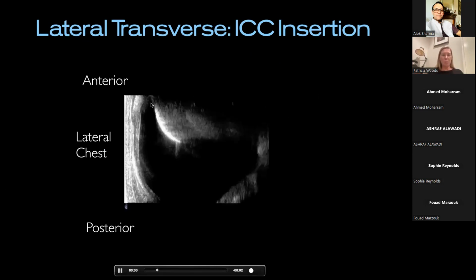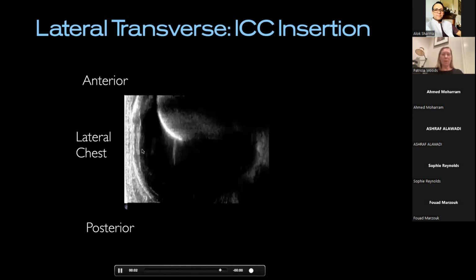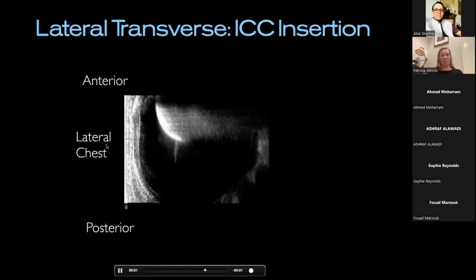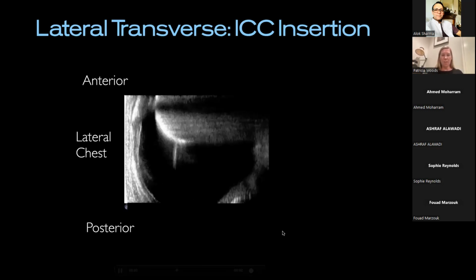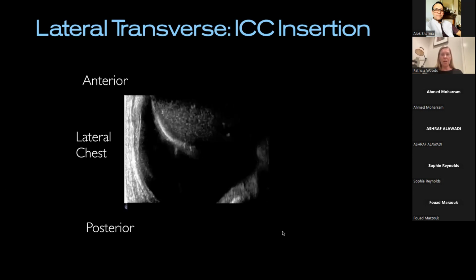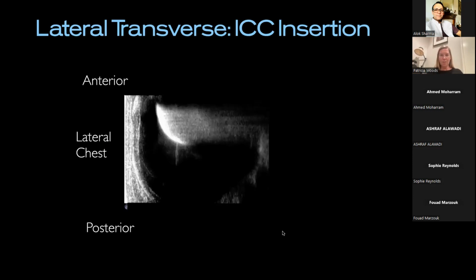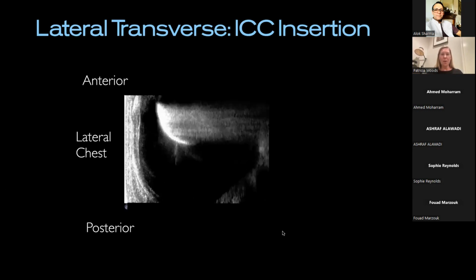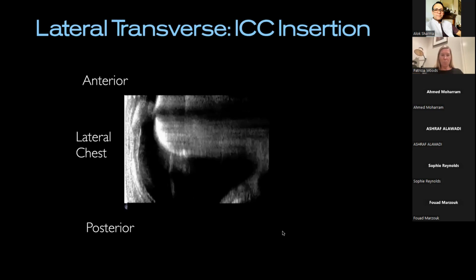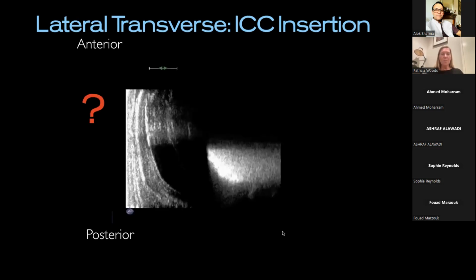And I think what you're observing here is this deep fluid pocket. You've got a lung suspending up here. And this was actually pre and post procedure. Pre-procedure, I'm able to see where my diaphragm is. I'm not going to kebab it as I put the chest catheter through the wall. I know the depth of chest wall I need to penetrate to get to that, and hopefully all should be well. But this was post-imaging.